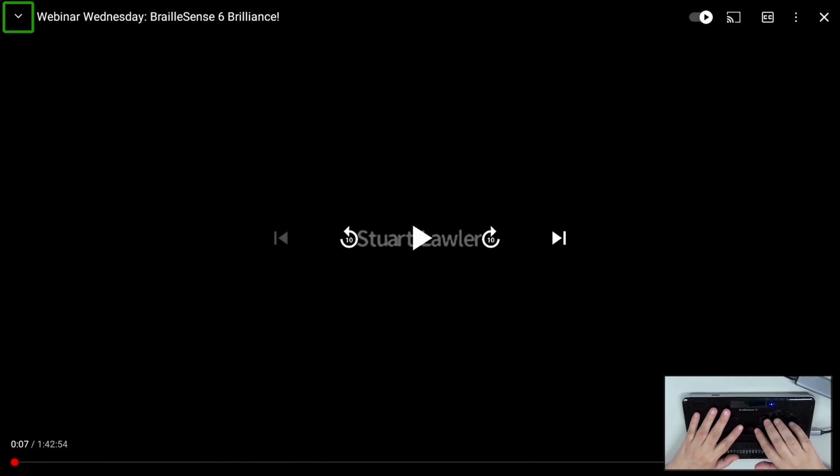The other thing that you want to do is hide the controls so that you don't see the play, pause, and all of that stuff. The only thing about that is you've got to do that while it's playing. So I am going to restart the playback, and then I will hide the controls. Button disabled previous video. Button play video, press Enter to activate.